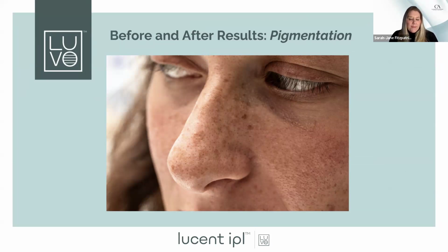But one of the questions that came in with Fitzpatrick skin type is: someone is a 2 in the winter, but a 3 in the summer. How would you treat? Well, a 2 to a 3 can be exactly that. Like, I am right now a 2, and if you get me in September, I'm a 3, and you have to follow that. If I'm a 3 at that time, then you have to treat me as a 3.